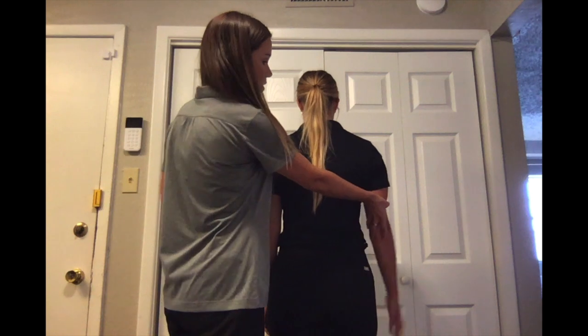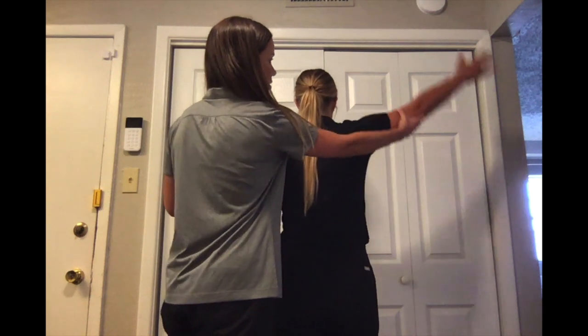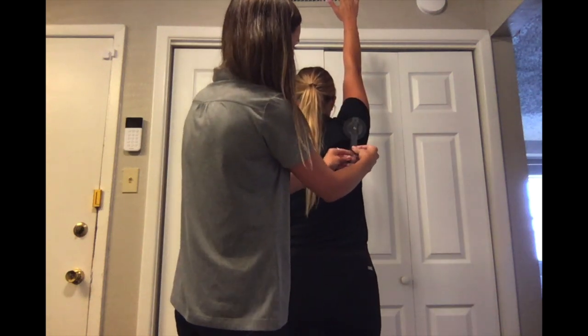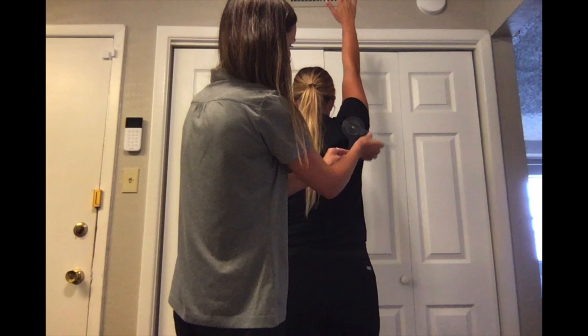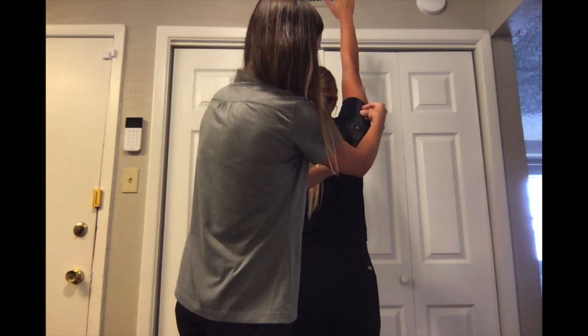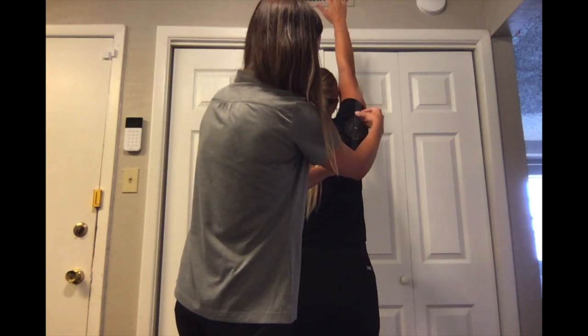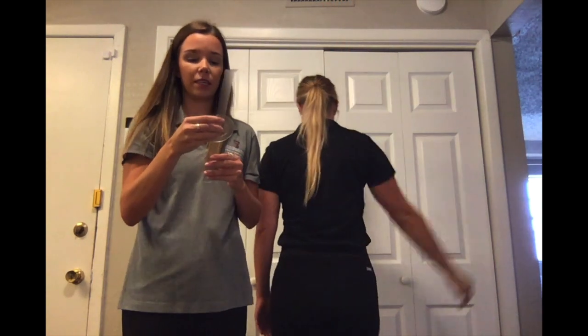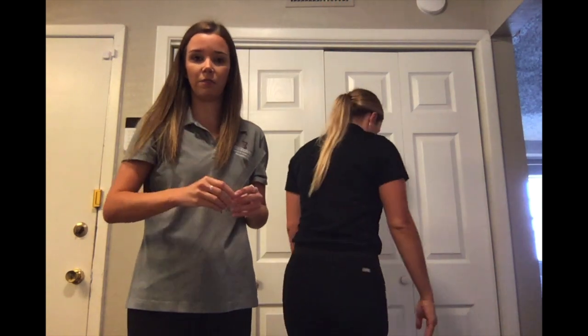Addison, I want you to raise your arm up like this as far as you can. Can you give me any more? Addison is at 175 degrees of shoulder abduction. The norm for shoulder abduction is about 170 degrees.